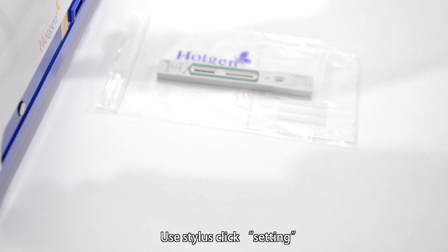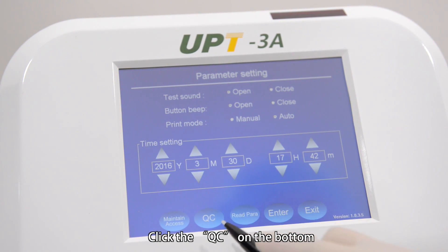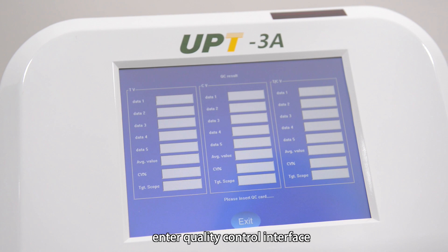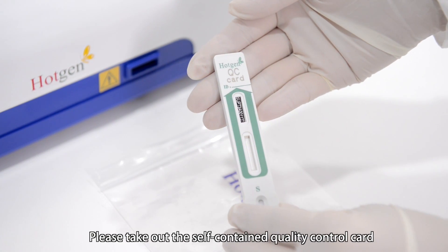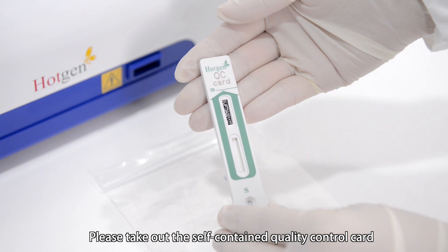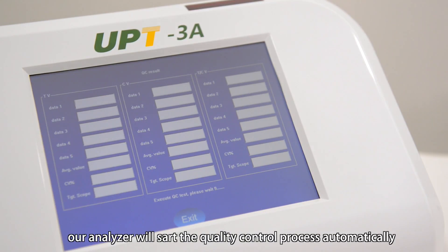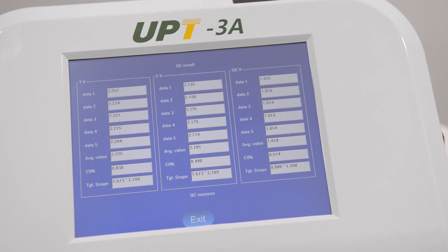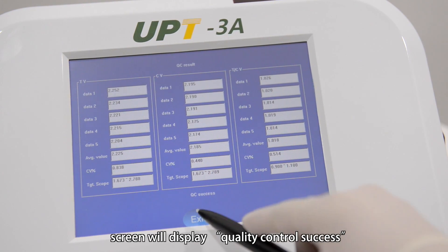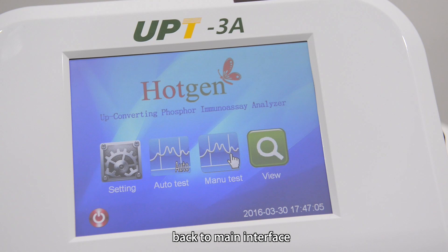Use stylus to click setting and you will enter the set interface. Click the QC on the bottom to enter the quality control interface. Please take out the self-contained quality control card and insert it into the card slot. The analyzer will start the quality control process automatically. When quality control is finished, the screen will display quality control success. Click exit to go back to the main interface.